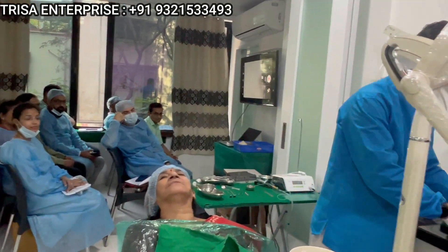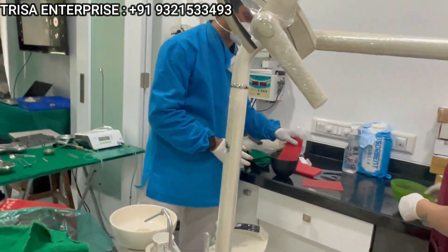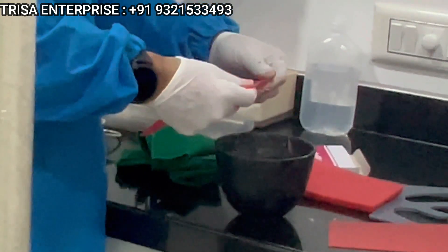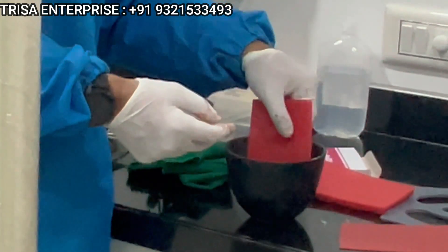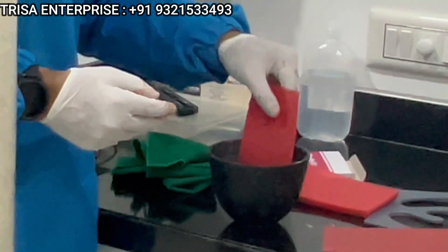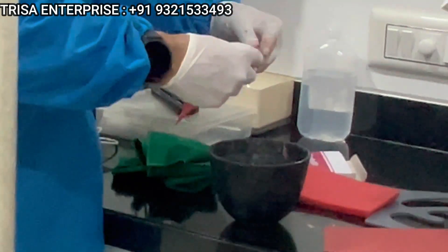Okay, so this is the hot water. We are just going to temper some modeling wax. We are just going to prepare the fresh wax.